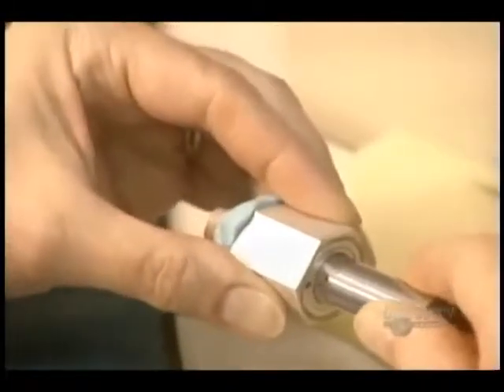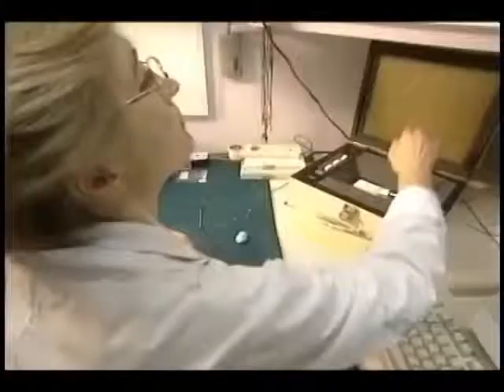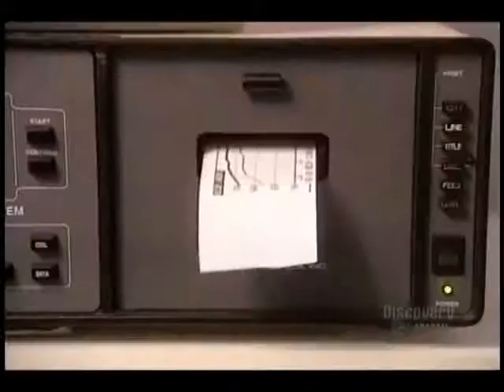The prosthesis is now completed. There remains one important step: verifying its electro-acoustic characteristics. It's with this analyzer that they validate the hearing aid conforms to the original prescription.